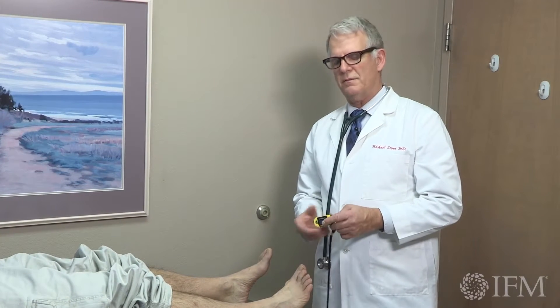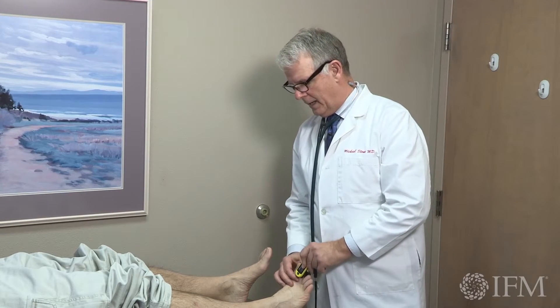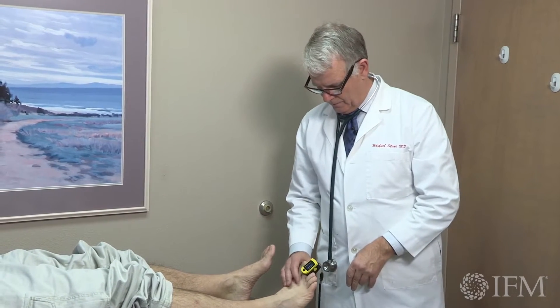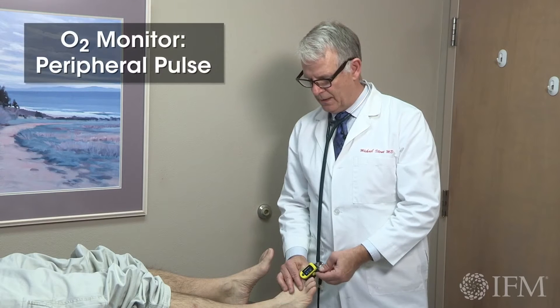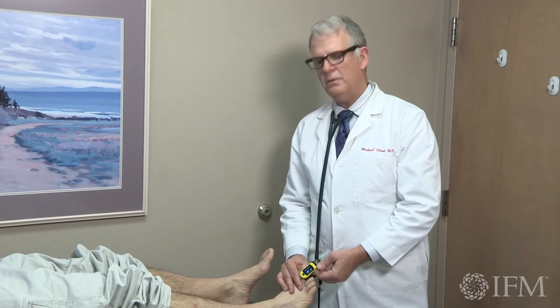The oxygen saturation tool is a very inexpensive, less than $50 item that you can pick up, and it really gives you a clue to a few things. It allows you to see in the most peripheral portion of the body whether it's picking up any type of pulse, which you can see it is, and it also gives you the oxygen saturation of that tissue.